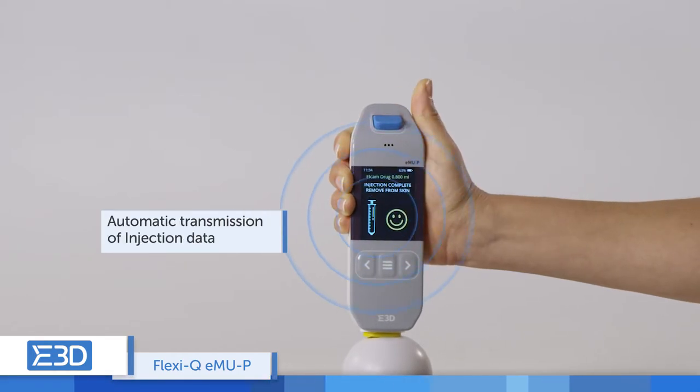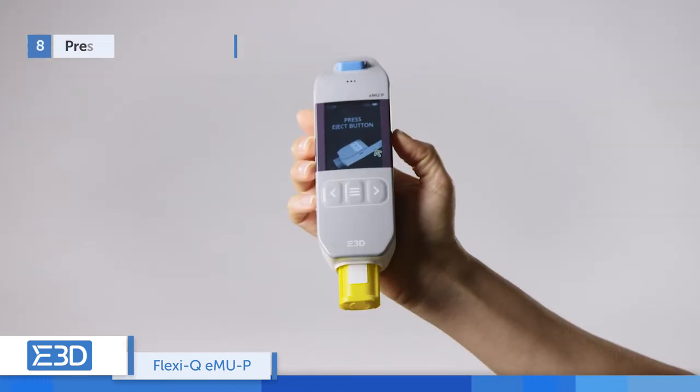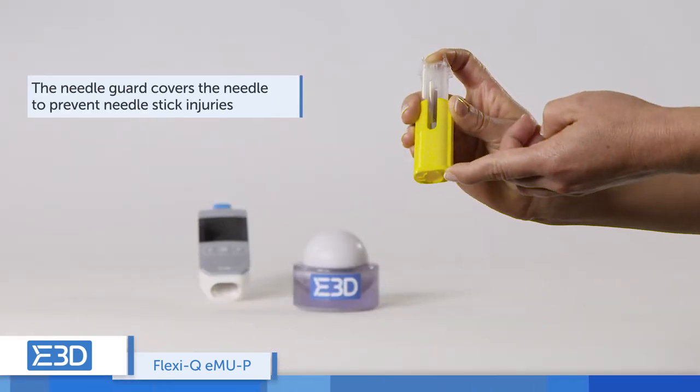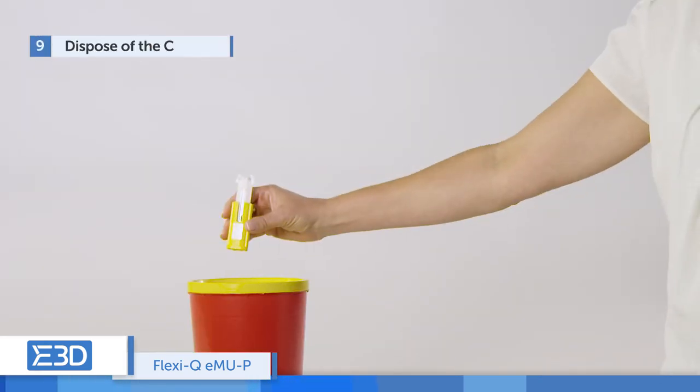Once the injection is complete, remove the device from the skin. Press the eject button to release the cassette. Remove the cassette — the needle guard covers the needle and prevents needle stick injuries.